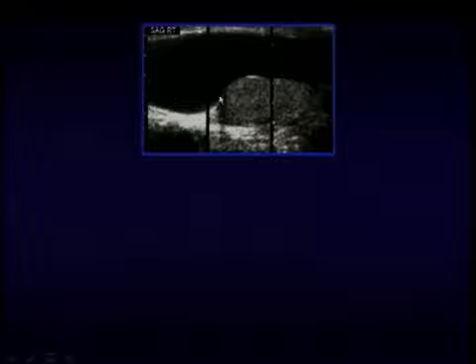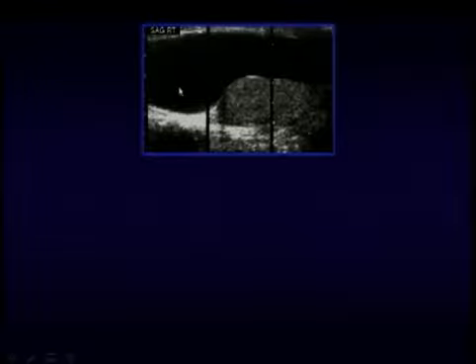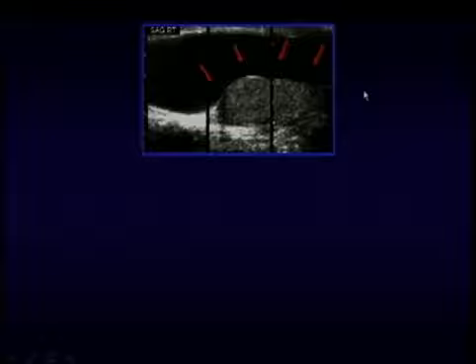So here we have a large hydrocele, but notice this patient's lying on their back, and the testis is here, but there's no fluid behind it. Well, why is that? You would think with gravity there should be fluid behind here, but there's not, because at this level, which is the level of the epididymis, there is a solid attachment of the scrotum and epididymis to the scrotum itself. So there's no fluid behind it.